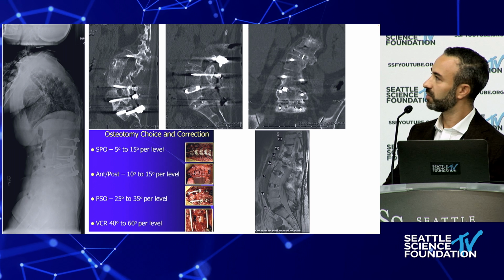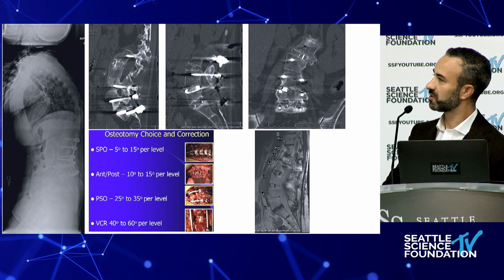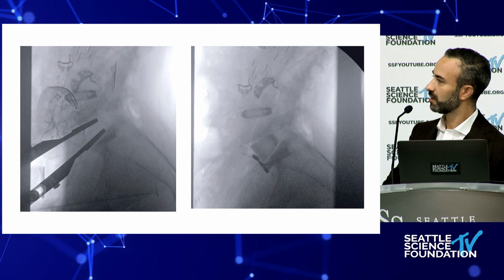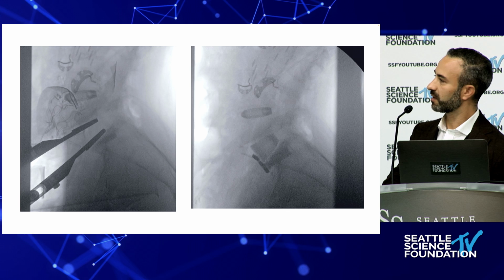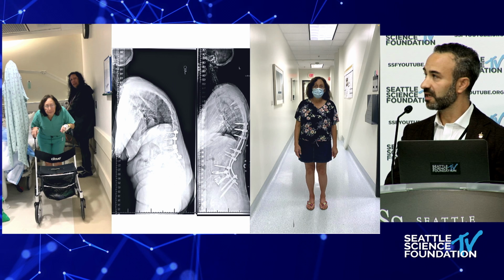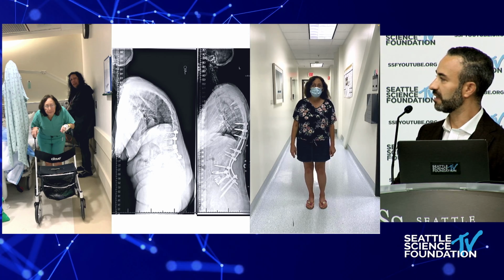And you can see that potentially the problems over here are coming at the lumbosacral junction, at the L5-S1 junction with pseudarthrosis, and that gapping open you can see on the supine CT. So the choice for a hyperlordotic ALIF for anterior column support was considered, with posterior fixation, avoiding a posterior column, three-column osteotomy in this patient.